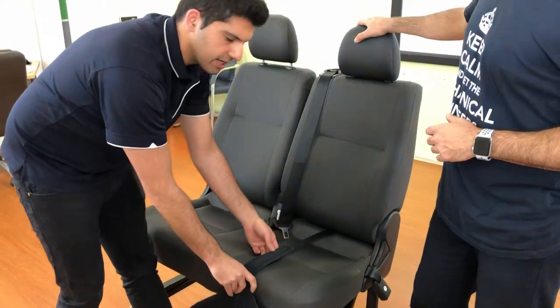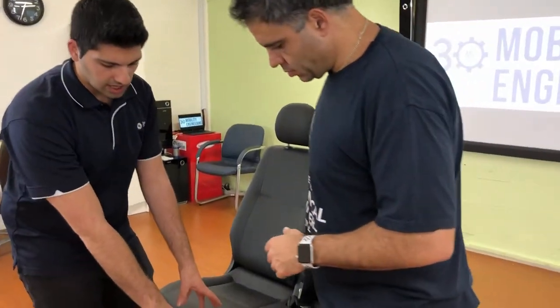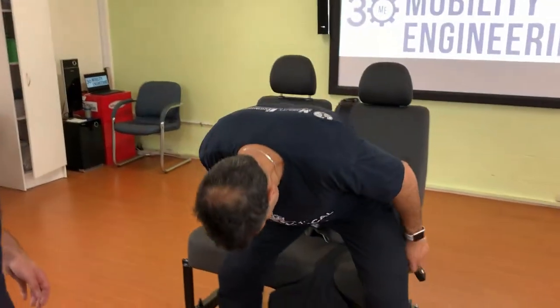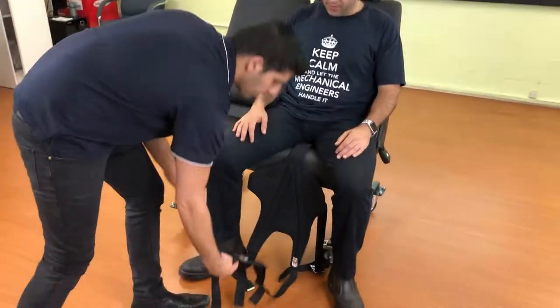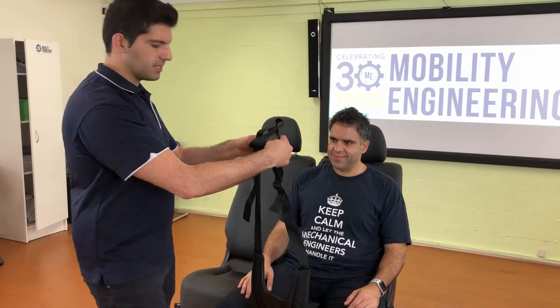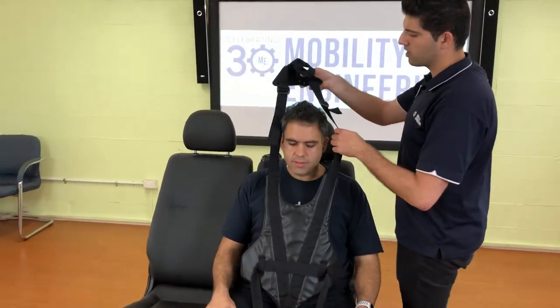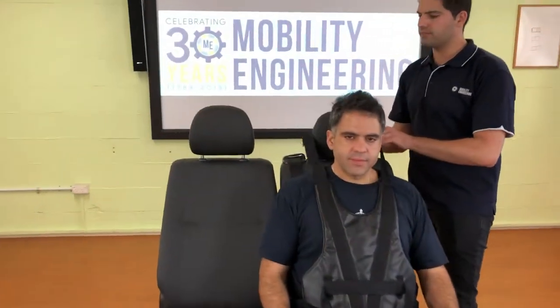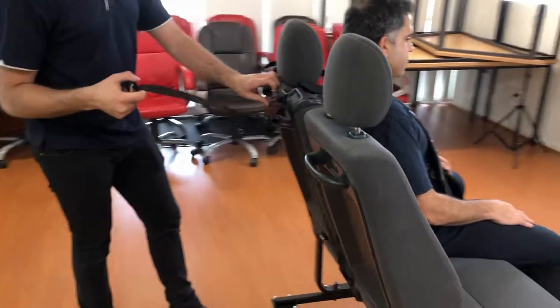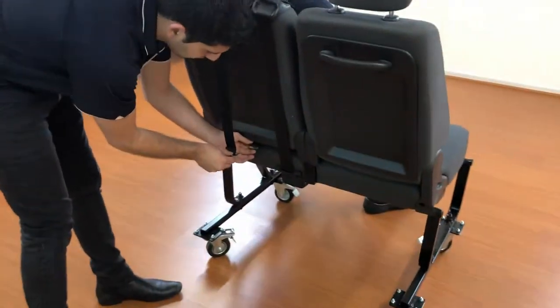Once the buckle is fed through and on the other side, the client can proceed to sit into the seating position. Usually with the harness we'll just leave it flopped onto the front of the seat. The occupant sits into the harness, then we lift this area here — it's important to hold the hard components in your hand so you don't accidentally injure someone. We pull the harness over the client's head and the headrest, then buckle it up so it matches with the buckle fed through earlier.